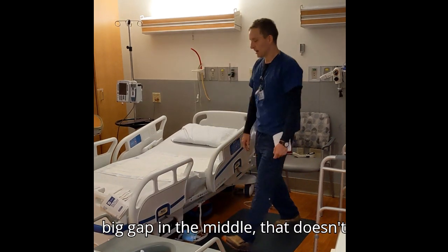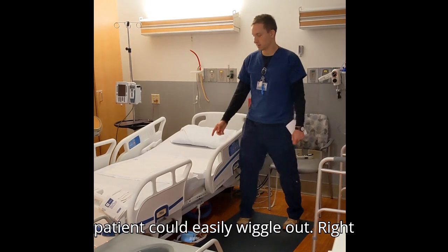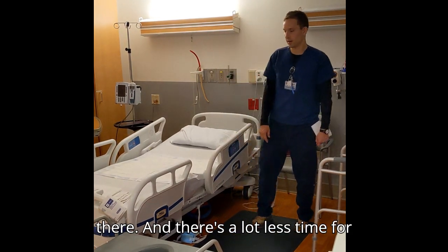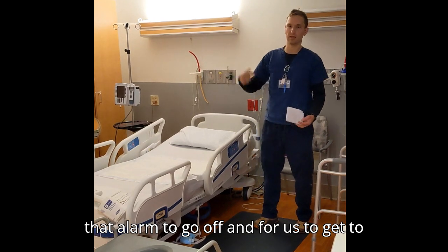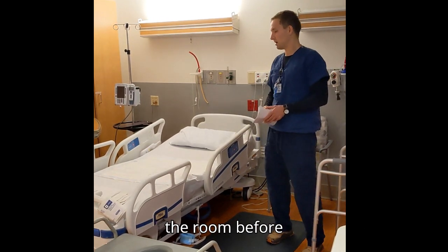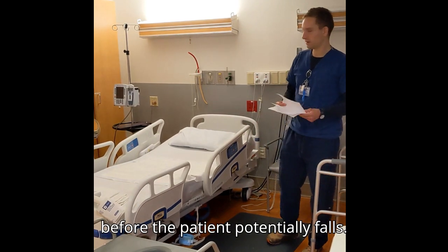If we have this big gap in the middle, that doesn't really help us so much because the patient can easily wiggle out right there, and there's a lot less time for that alarm to go off and for us to get to the room before the patient potentially falls.